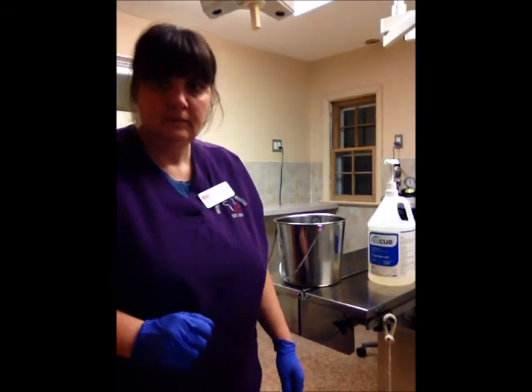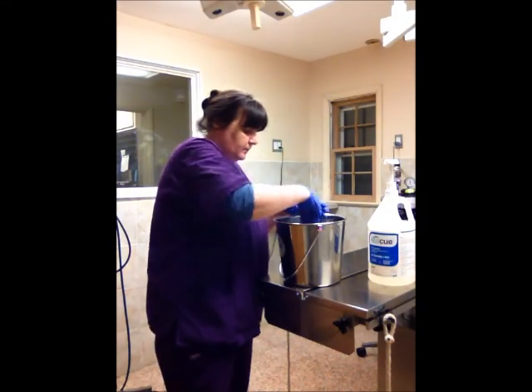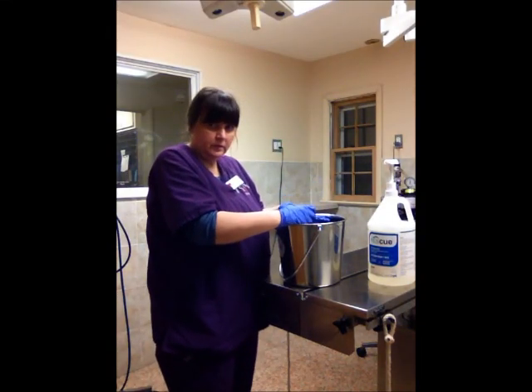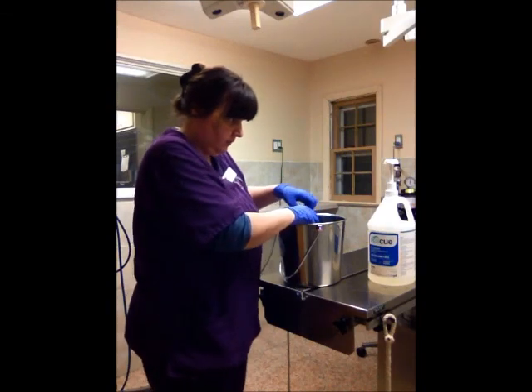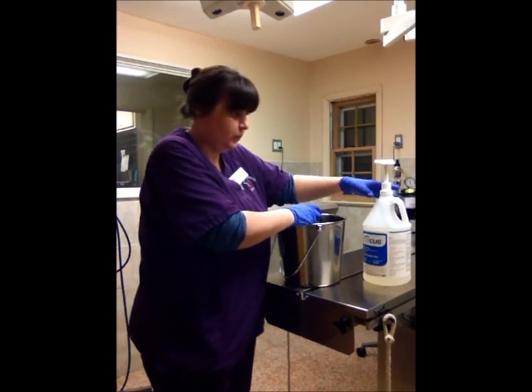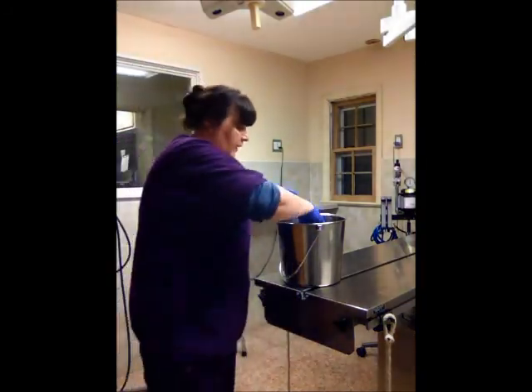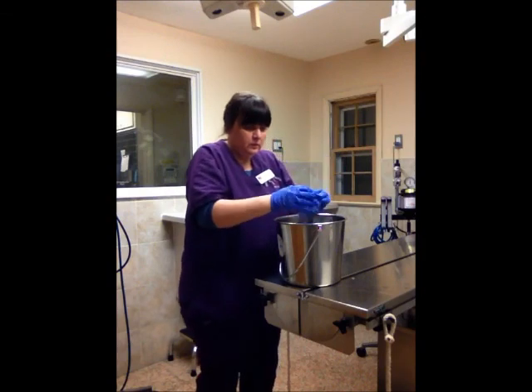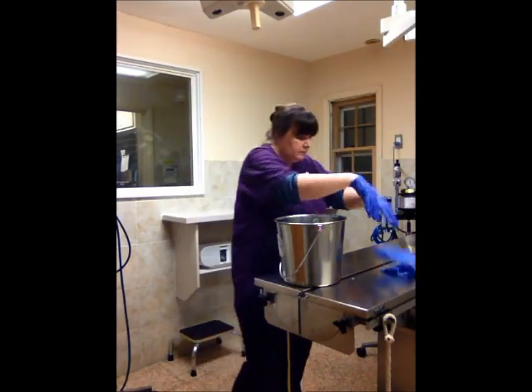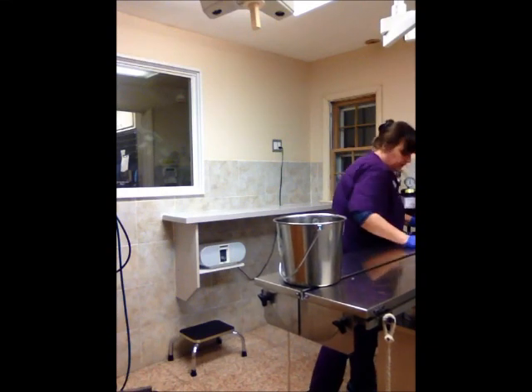Okay, so when we're cleaning the OR, we will take our bucket of water, and we usually make it a 1:64 ratio of rescue and water. Put this over here for now. And we wipe everything down, everything gets wiped down with this and allowed to air dry.